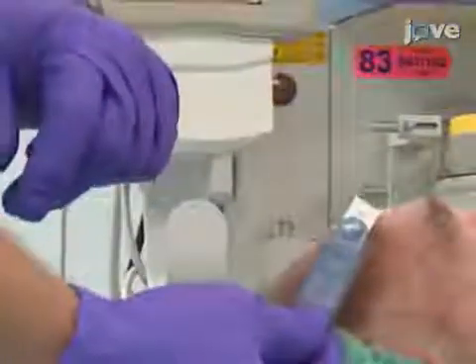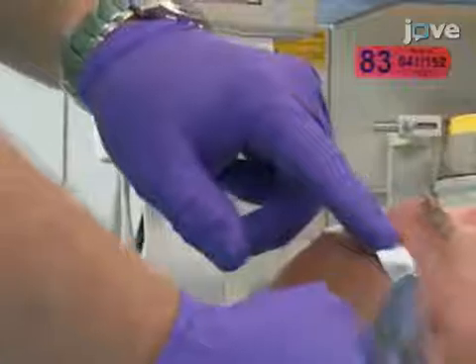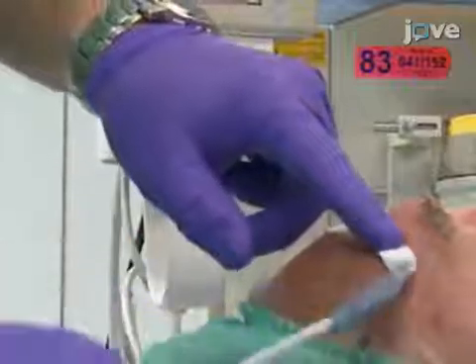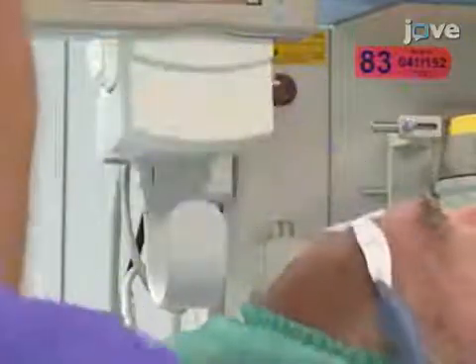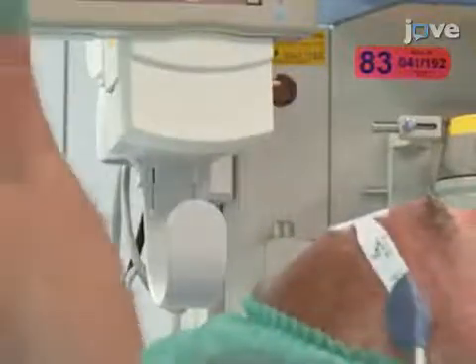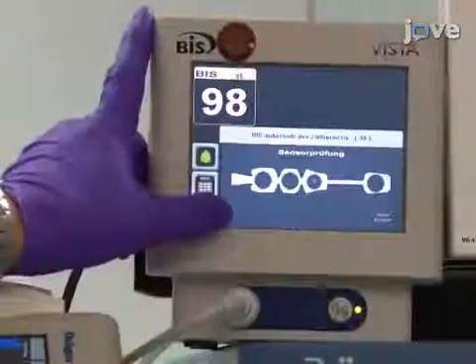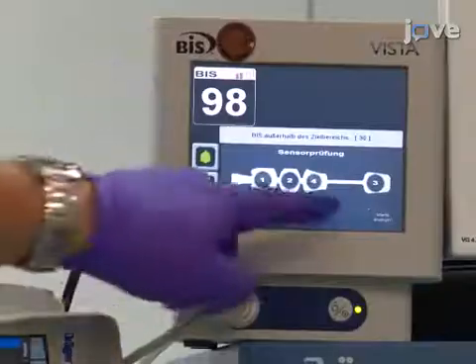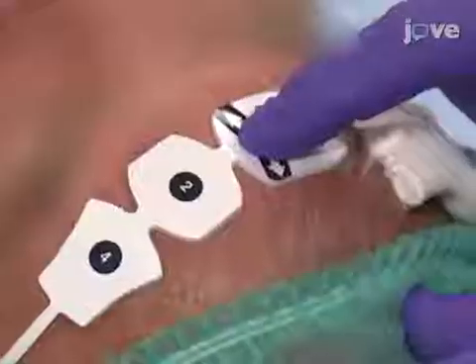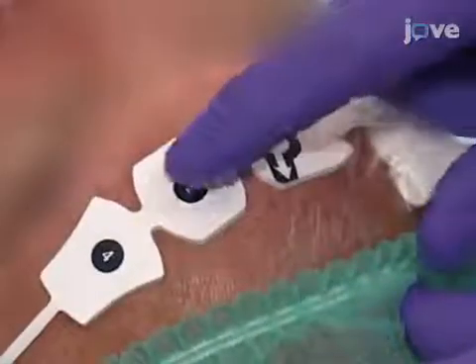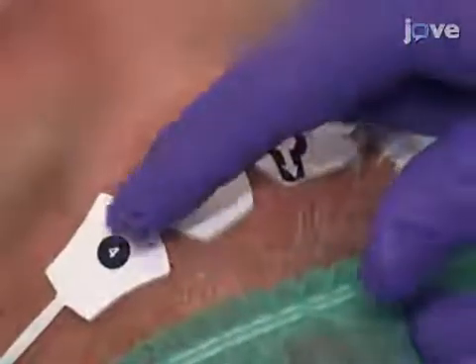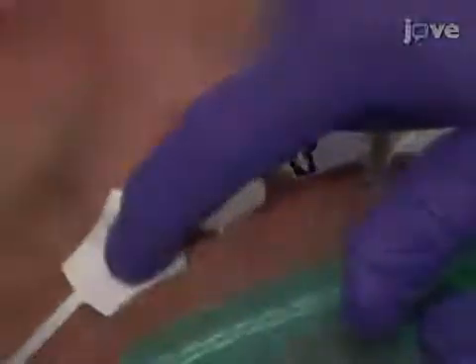When all of the electrodes are in place, connect the sensor interface cable to the bispectral analysis monitor, pressing the electrodes firmly to confirm that the automatic sensor test is passed.